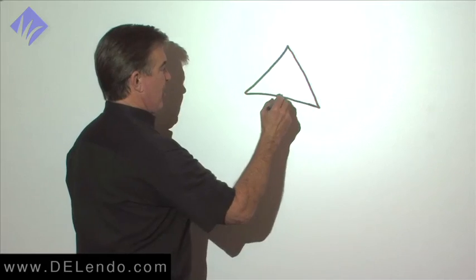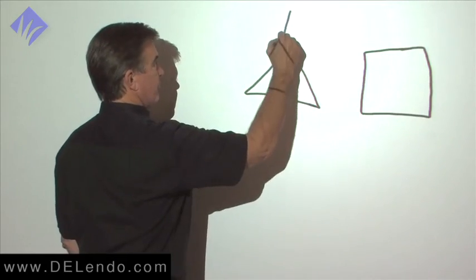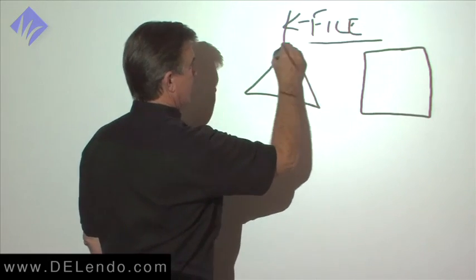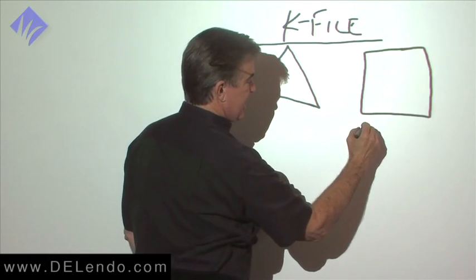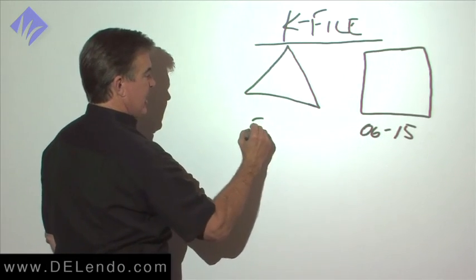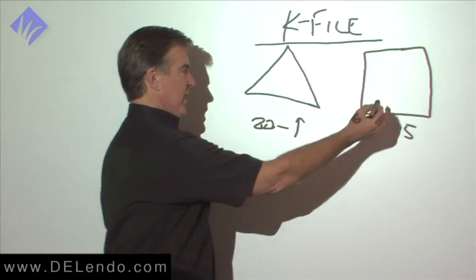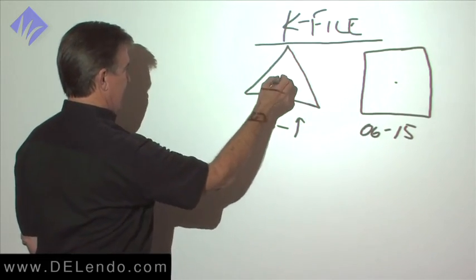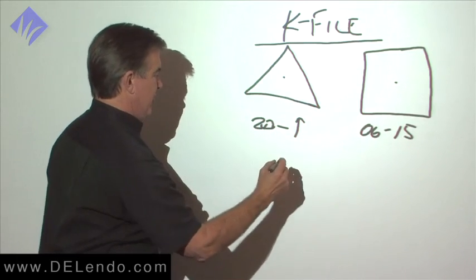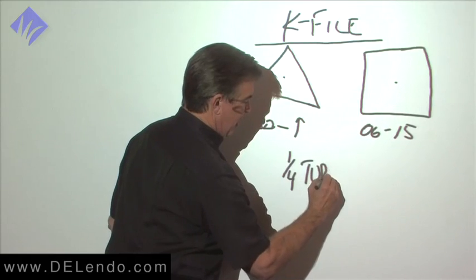If we look at a K file in cross section, they're square or they're triangular. Okay, sizes 06 to 15 look like this. Sizes 20 on up are usually triangular. We need strength in the small files and we need flexibility in the larger files. Well, traditionally we've used quarter turn pull, as it's called.